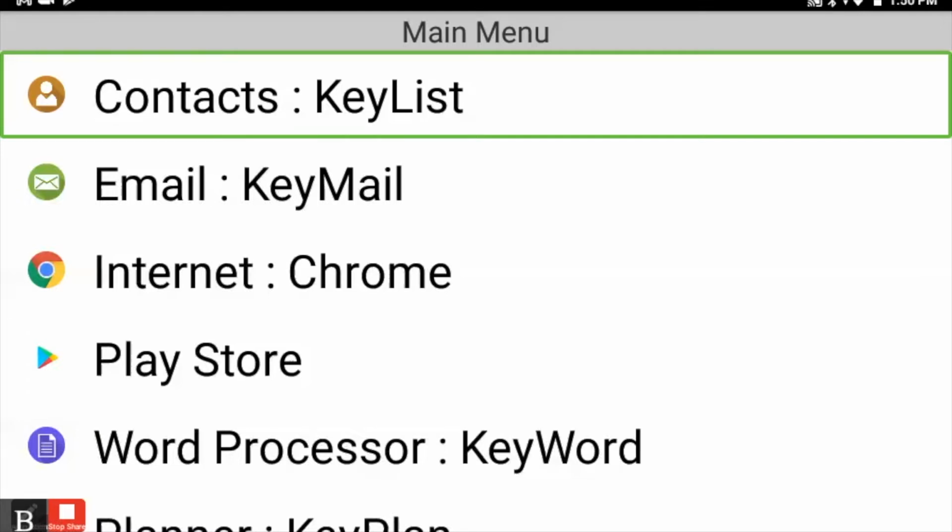So your cursor router keys, again, for those who are not familiar, are above each one of your Braille cells. Now, if you're not totally sure what a Braille cell is, basically one Braille character is one Braille cell. If you find a Braille character on your Braille display and go directly above it, you're going to find a little rounded button that feels almost like a bigger Braille dot. Those are your cursor router keys, and there's one above each one of your Braille cells, or each one of your Braille characters.